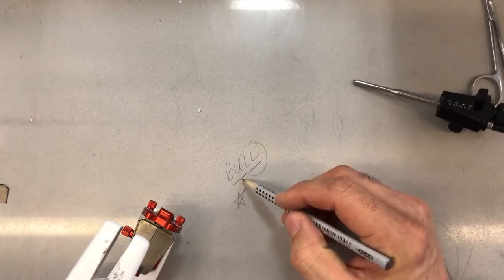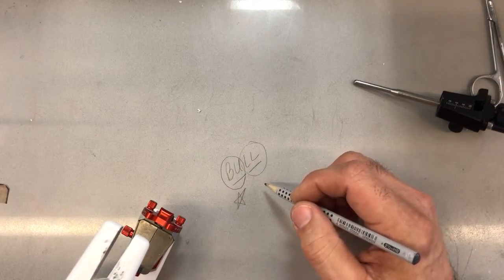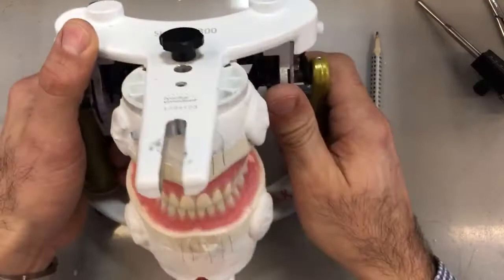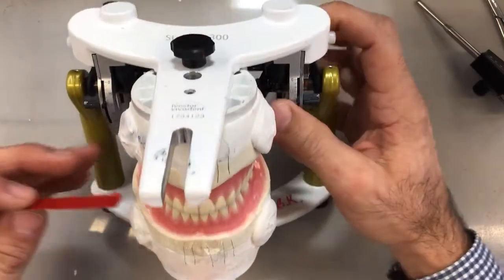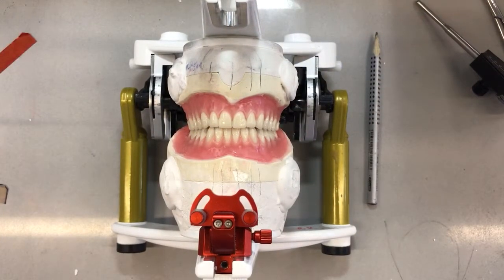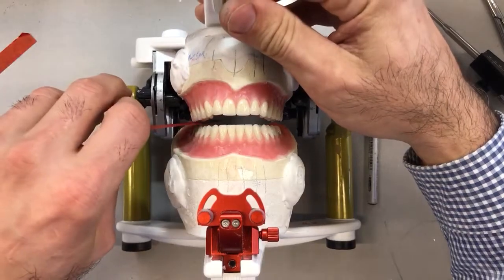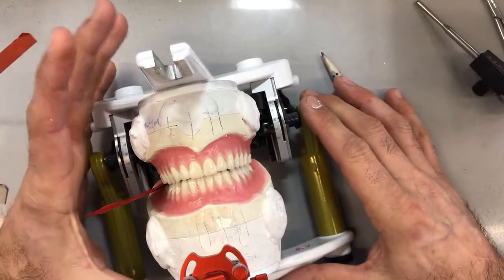Following our BULL rule — if we're going to reduce anything, we start by reducing the lingual cusps of the lower and/or the buccal inclines of the upper. I'm going to start off by inserting my articulating paper. You can do one quadrant at a time, but I'll use a wider piece and do two teeth at a time, placing the articulating paper between the molars on one side.